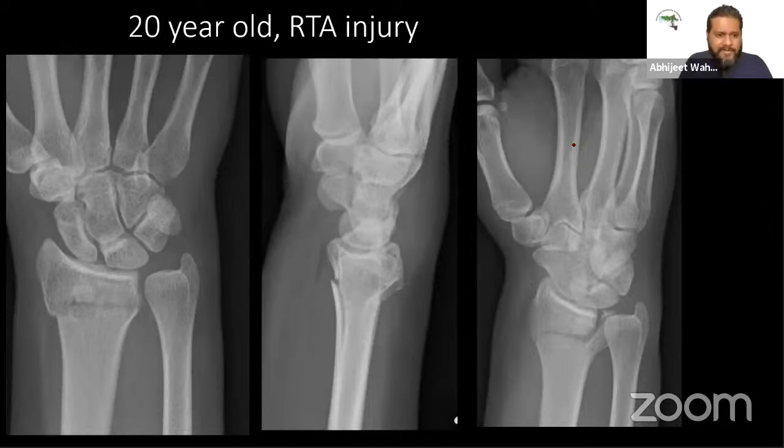Very quickly, another example where some more additional investigation may be required. Here we just got traction views and did nothing more than that. This particular X-ray again is a fracture, but there is something that meets.